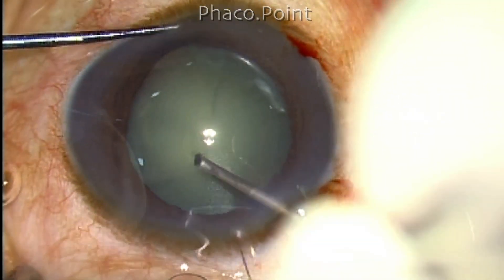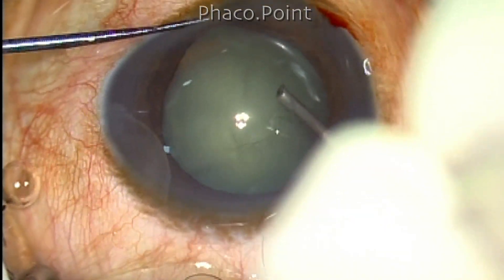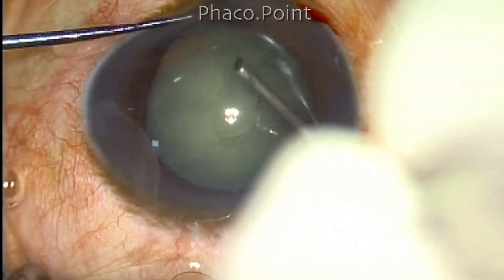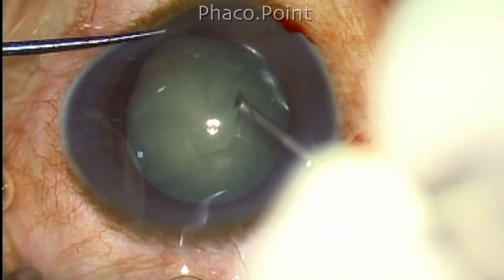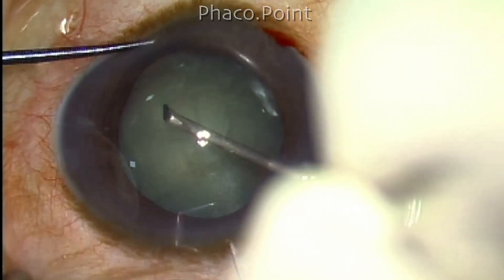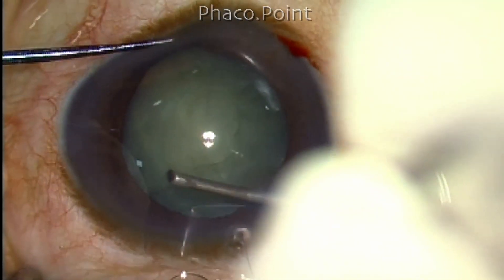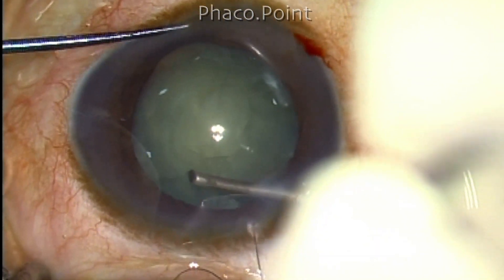Let me demonstrate this in this case. This is a grade 2 nucleus sclerotic cataract; the capsulorexis is being carefully performed. The visibility is not very good — probably I should have stained the capsule. There is no red glow at all.